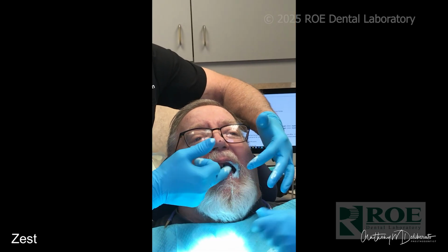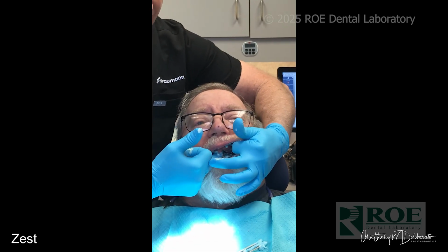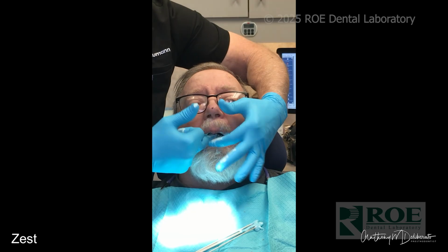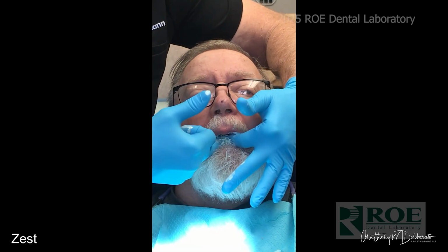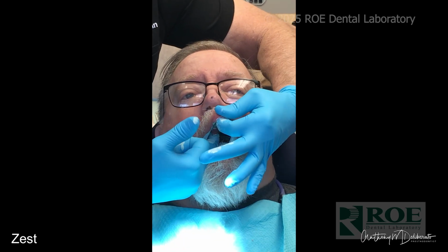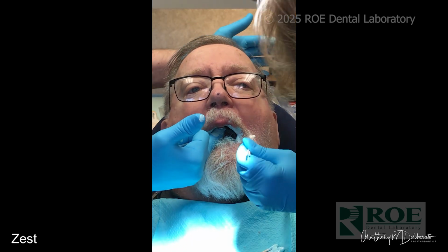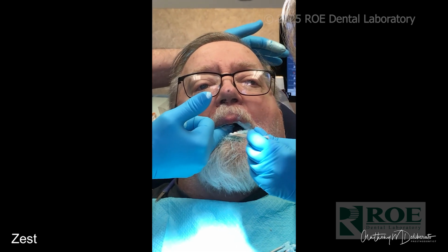Big disadvantage is that's the messiest stuff in the world. If you ever get it on your clothes, throw the clothes in the garbage. Oh yeah, it took half an hour to clean up. That's old school rubber base. Well, it's not the old school; the brownish colored one is. But this is still old school too. I do removable impressions with polyvinyl, but I just never think it's as good as what I get with this.